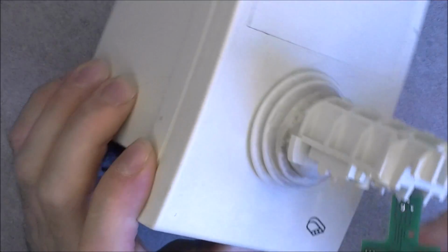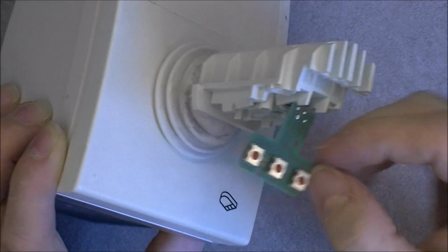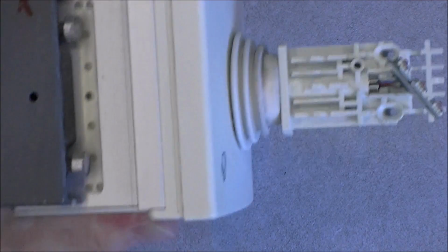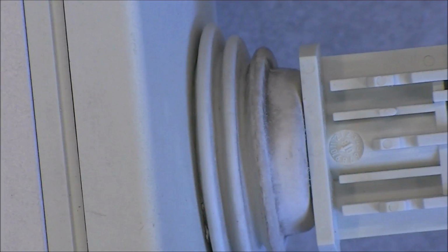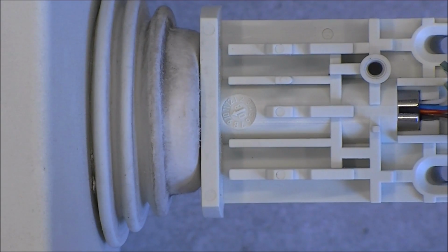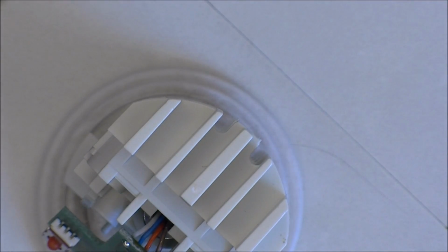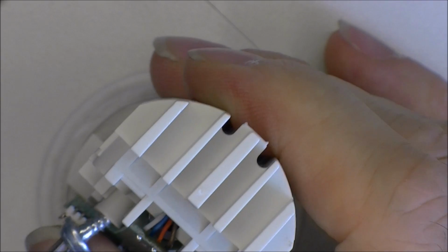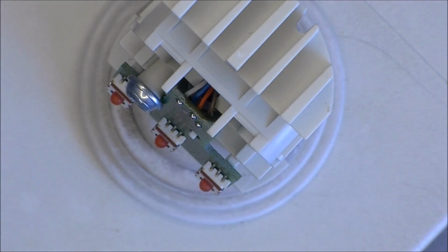So you can see 3 very small push buttons, quite nice ones apparently. And yes, I did forget about this, guys. We have a date code here. It looks like it is October 2008, just in the middle of your screen. Okay, so I will reinstall this screw because it is not necessary to remove this. I do not know if I can maybe undo the wires from the other side or not. We will find out probably.